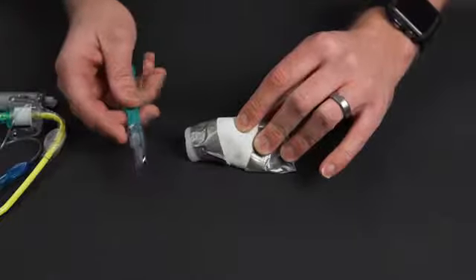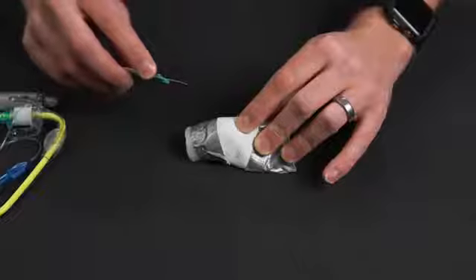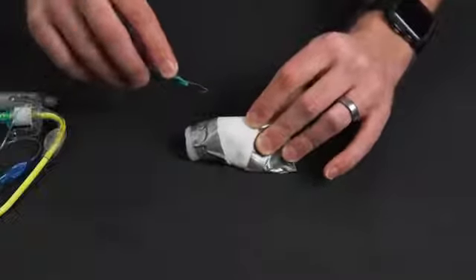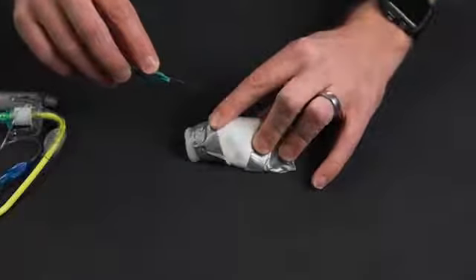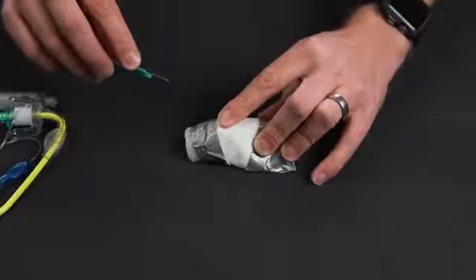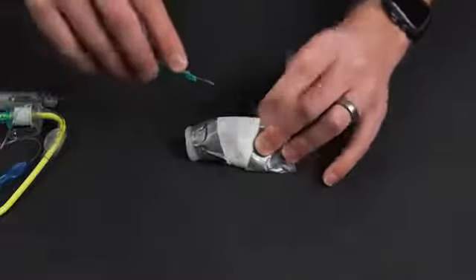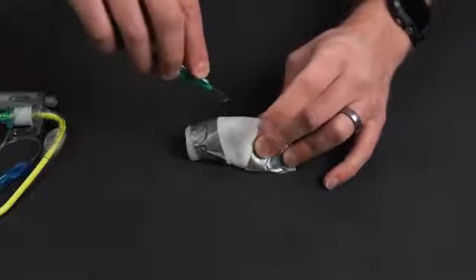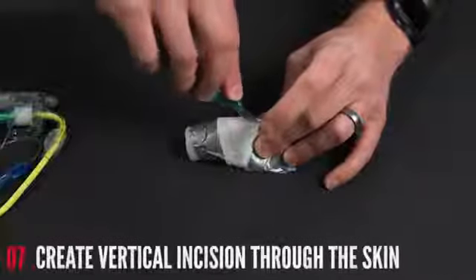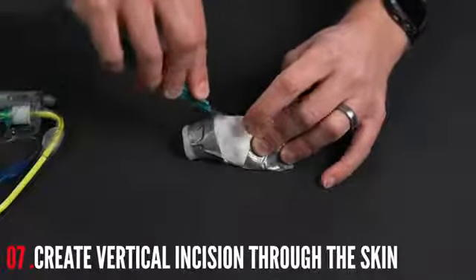I've got my scalpel here. Now, like I said, this is the traditional technique. So you can take the scalpel, and the first thing we're going to do is start just above that membrane, and we're going to come down and do a vertical incision through the skin, but not all the way to the membrane. We're not going through the membrane yet. So this is not painting. I'm not going to want to do a bunch of strokes. We're going to come here through the skin, and this is the first time I've tried it with this trainer, and we're going to cut down.